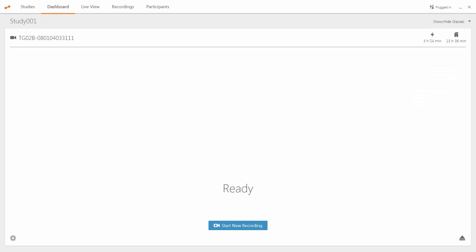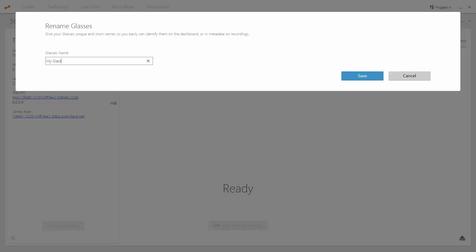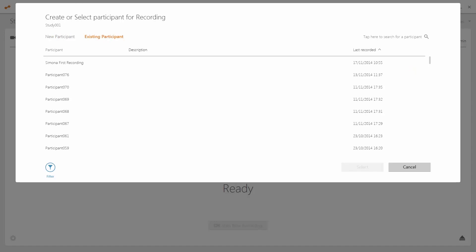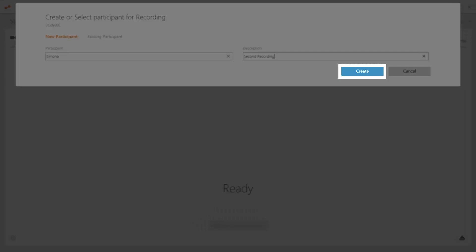Locate the glasses you wish to record with. Make sure that the memory and battery life are not low — these can be seen here. If you have more than one unit, you may wish to rename it. You can do this by clicking the settings button and then clicking rename Glasses. Choose whatever name you wish and click save changes. Now we can click on start new recording. We must now either create a new participant or choose one we've used before. You can add any relevant info about the participant here. When finished, please click create. You should now be able to see the live view tab, where you can see what the scene camera on the Glasses 2 sees.